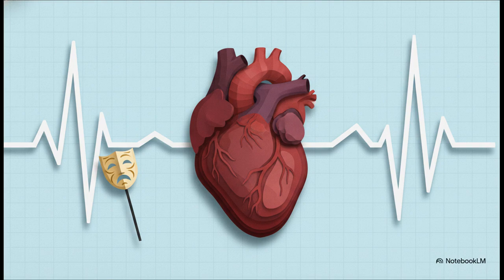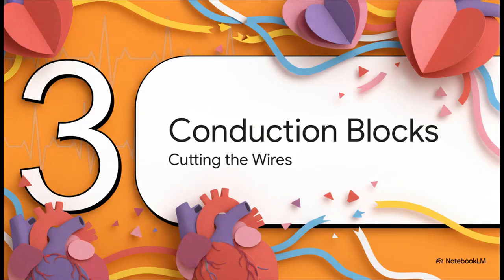As detectives hunting for infarctions, we've got to be super careful to distinguish this structural strain from actual ischemia. It's a notorious mimic. Okay, Section 3, conduction blocks, or what happens when we're essentially cutting the wires.